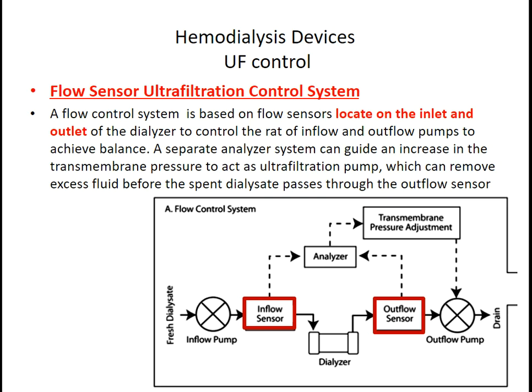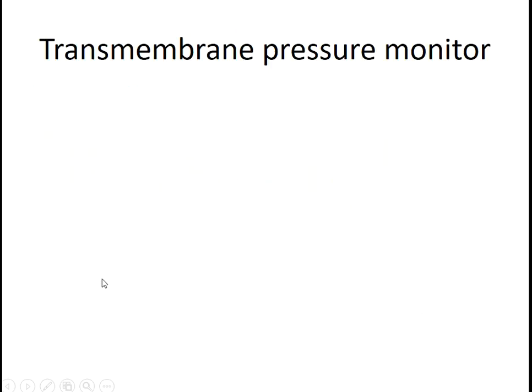A separate analyzer system can guide an increase in the transmembrane pressure to act as an ultrafiltration pump, which can remove excess fluid before the spent dialysate passes through the outflow sensor. We have inflow sensor, outflow sensor, analyzer, adjusting the transmembrane pressure. Transmembrane pressure monitor.